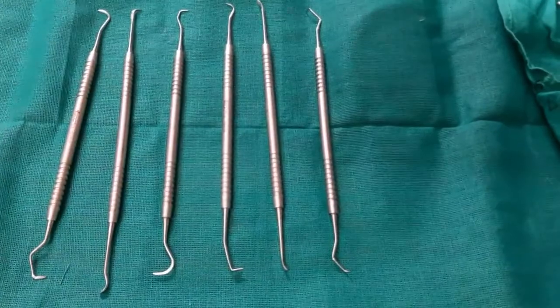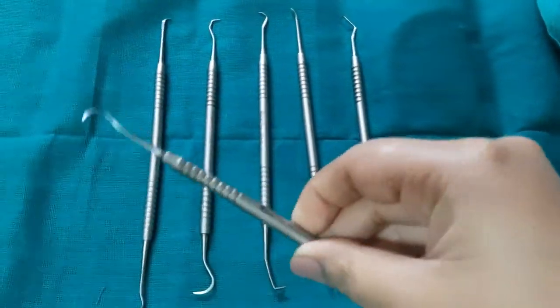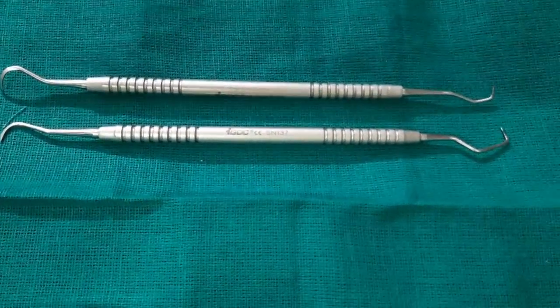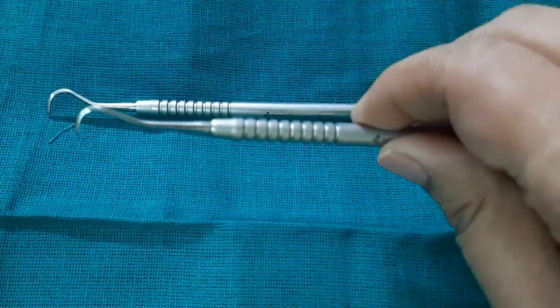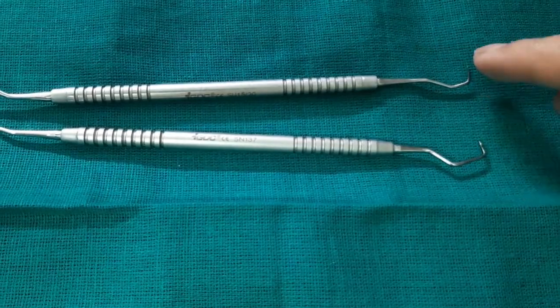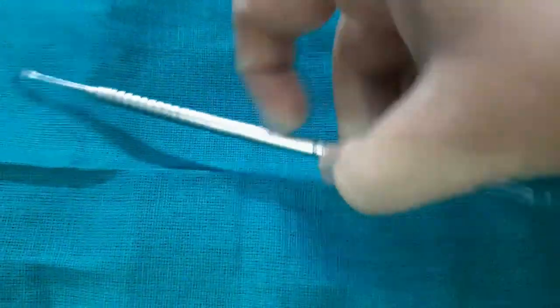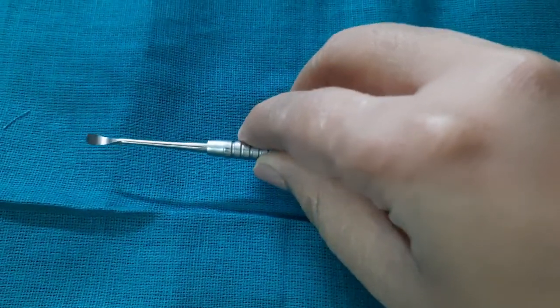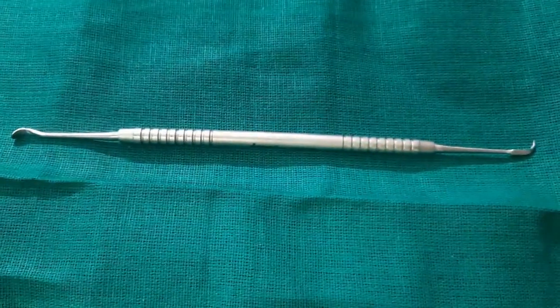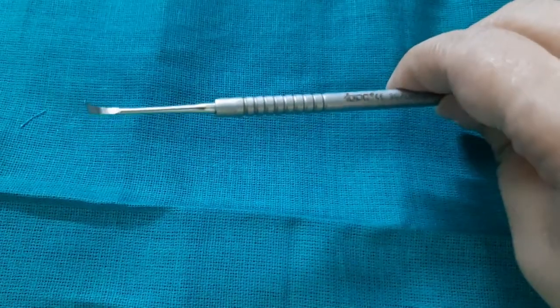Now comes the most important part of this video — the hand scaling instruments. Here I have six hand scaling instruments, after which I will show the root planing instruments. The first is the sickle scalar on one end and the anterior Jacquette scalar on the other end. You can appreciate its sickle shape and differentiate it from the anterior Jacquette scalar by its angulation. Next is a universal scalar, and on the other end we have the Cumin scalar, which is particularly used on the palatal surface or lingual fossa of the maxillary incisors.